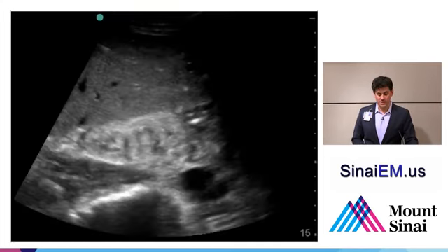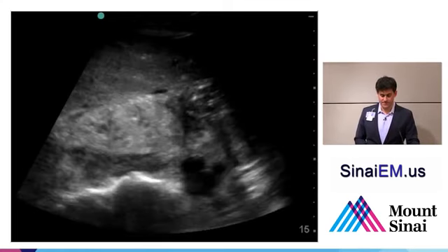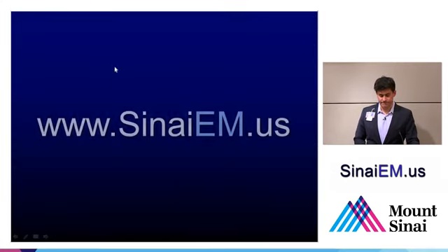So here we see, for example, a kidney in a patient who's a renal dialysis patient. So there's a smaller and very hyperechoic kidney. So tiny, bright kidneys are very commonly found in patients with renal failure. There's another example there, and comparing how bright this is to the relatively darker liver above it.